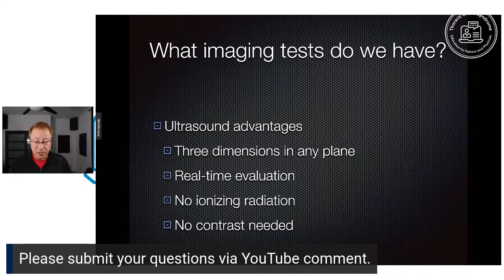So, advantages. Definitely has advantages. 3 dimensions, you can move to any plane you want. It's a real-time evaluation. You can watch things happening as you're performing the study. There is no ionizing radiation. It doesn't work on X-rays. That's great. You can do a test as long as you want, and the patient gets no radiation. And there's no contrast that's needed for examination of the thoracic outlet.